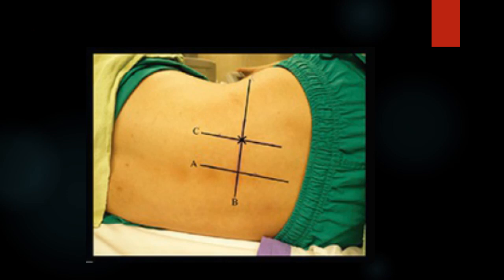Patient is placed laterally with hip and knee flexed, and skin marking is done: A, midline; B, intercristal line; C, sagittal scan line; X, a point 4 cm from the midline along the intercristal line. Sagittal scan is performed at line C. Transverse scan is performed on line B, above the line C, and on point X. Point X is the entry point for needle insertion for all approaches.